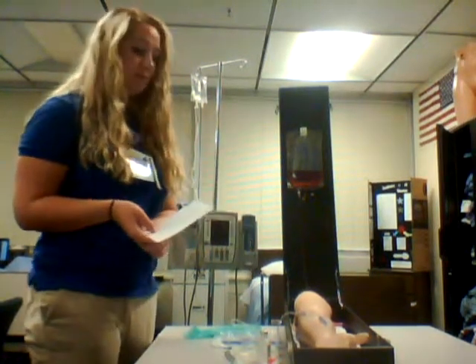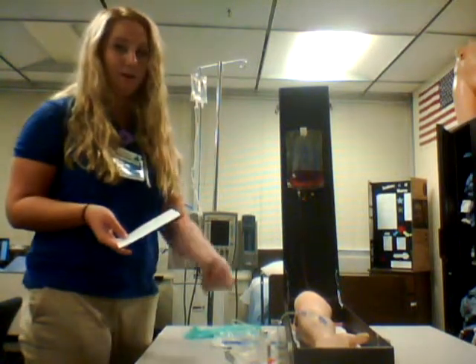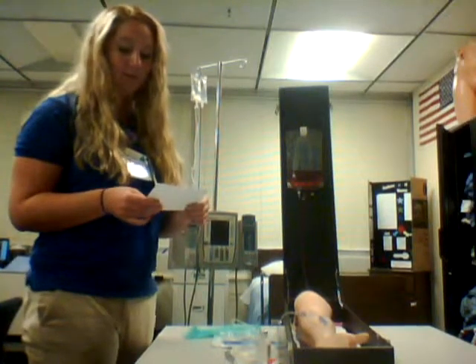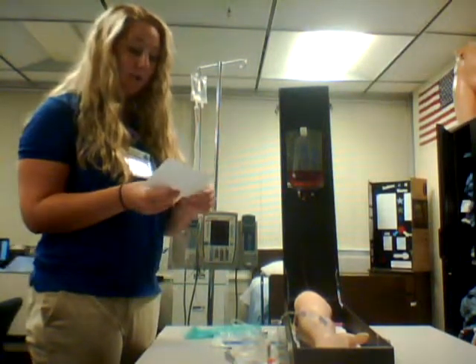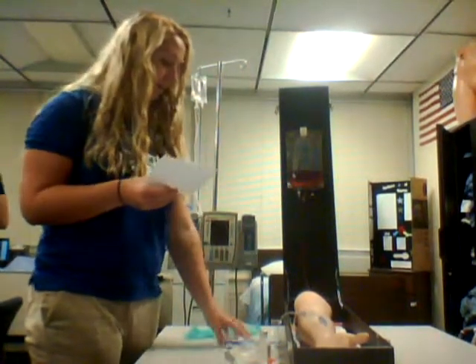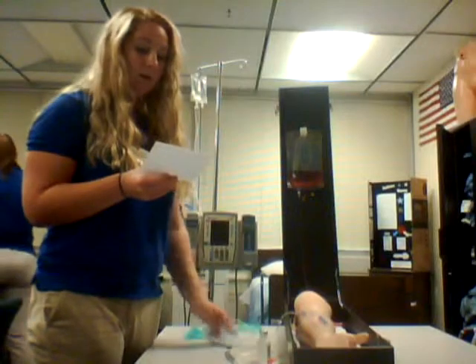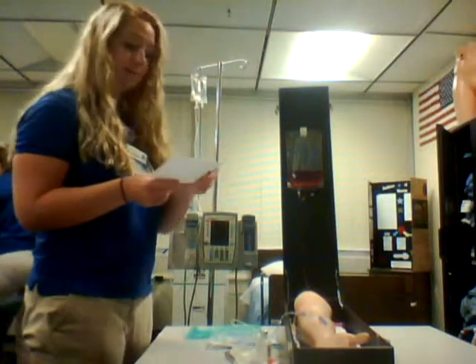I would also monitor the correct labs, so I see that I'm using this as an antibiotic. The patient's white blood cell count is elevated. And I have already calculated my flow rate, and it would be 100 milliliters over 60 minutes, and the drop factor on my tubing is 10, so that would be about 17 drops per minute.